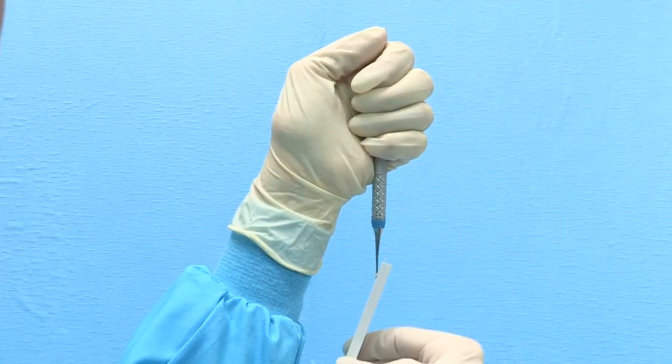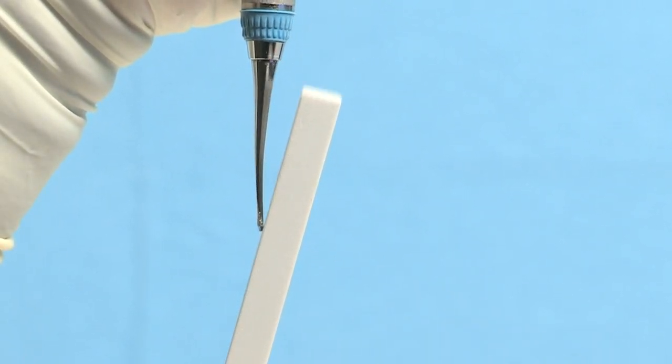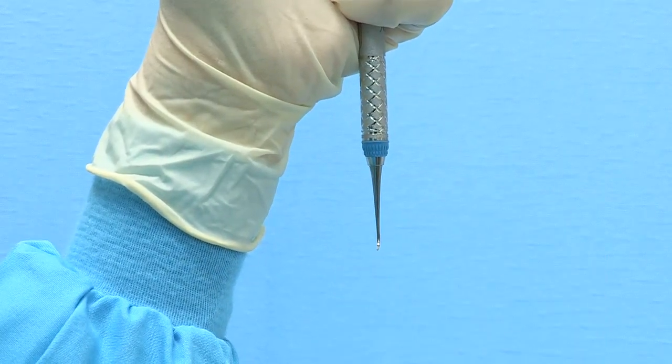Initiate sharpening in a fluid up and down motion, starting at the heel third of the blade, and slowly progress by moving the stone to the middle third and finally to the tip third. Maintain the stone in a continuous up and down motion using long strokes and moderate pressure. Finish on a downward stroke.